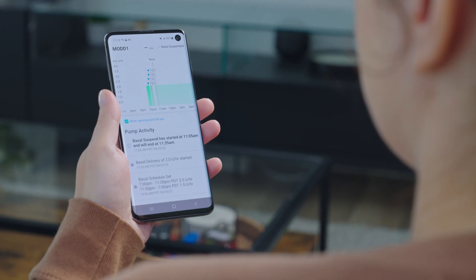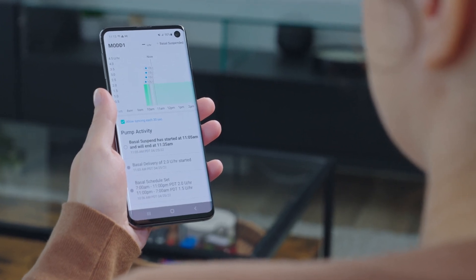We offer a phone app that monitors pump activity, providing peace of mind and a means to share history with your healthcare provider.